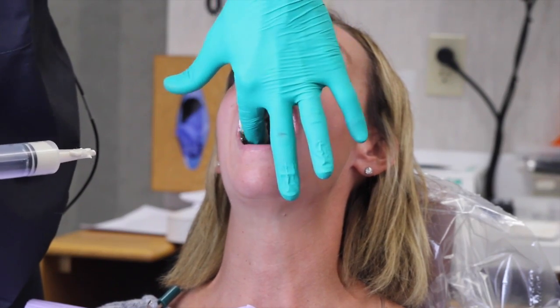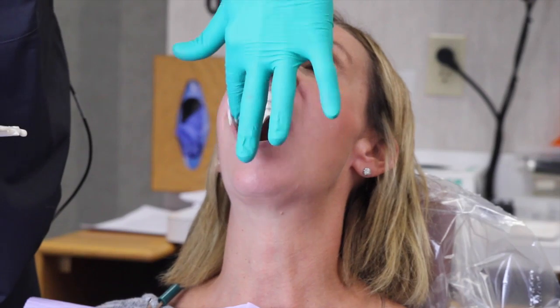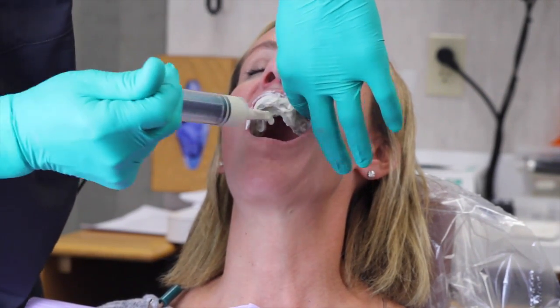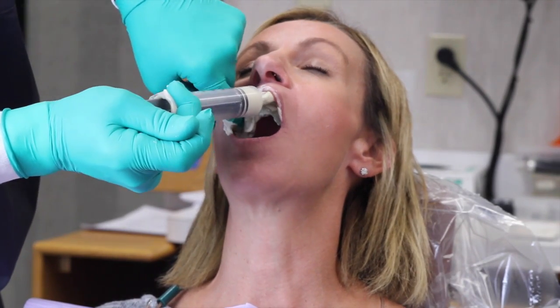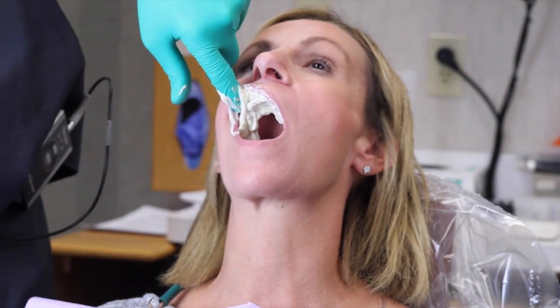And this is where I get messy here. But we sacrifice a little bit of neatness for accuracy and detail. So I'm making sure we have not just the occlusal table, but also the buccal and labial aspects of the teeth. And then I'm going to use the last little bit to go one more time into the vestibules. Set that aside.